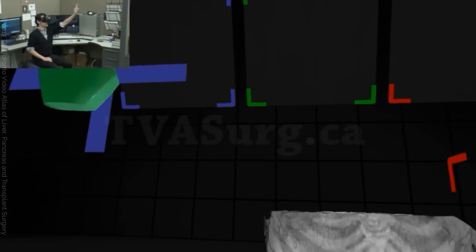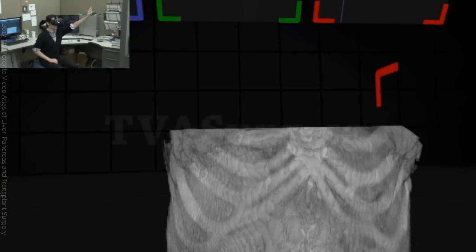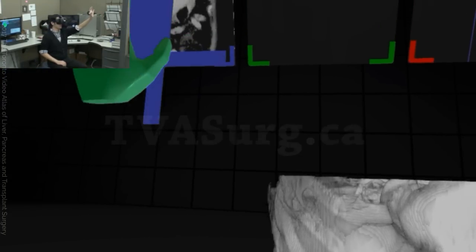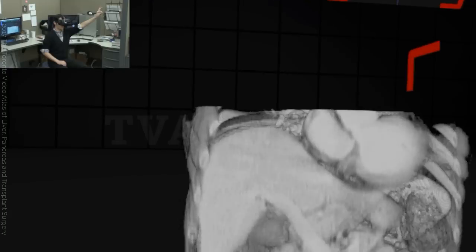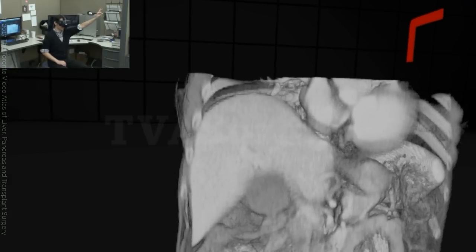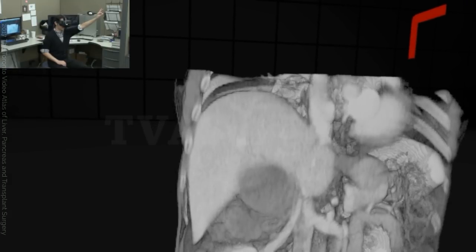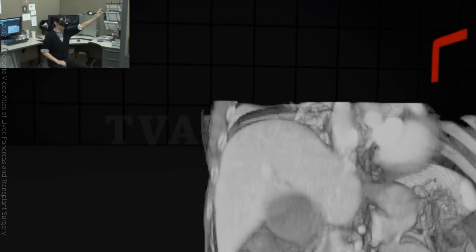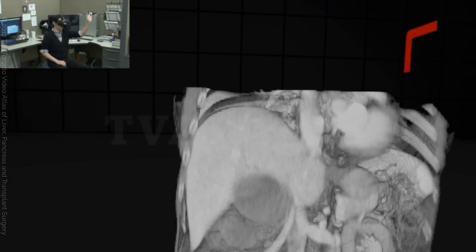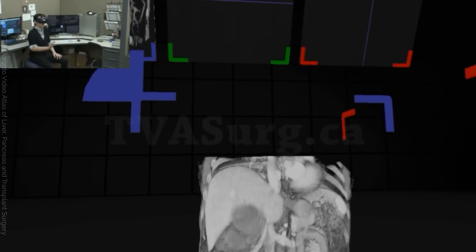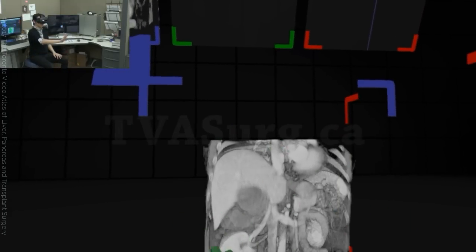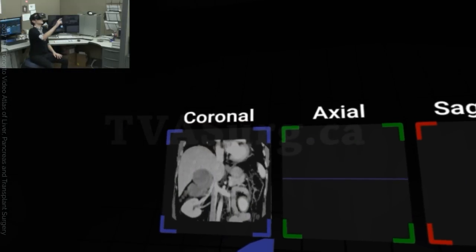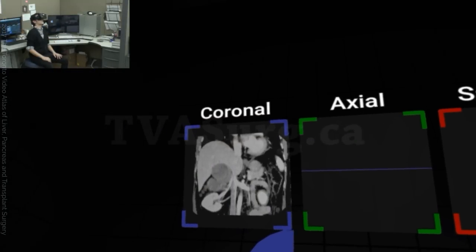We then started slicing the volume, much like how certain CT viewing software would do. As you can see, this cut surface here correlates with the coronal slice seen in the CT series.